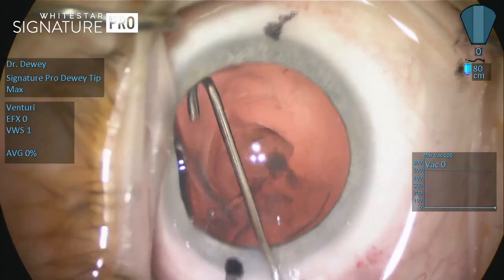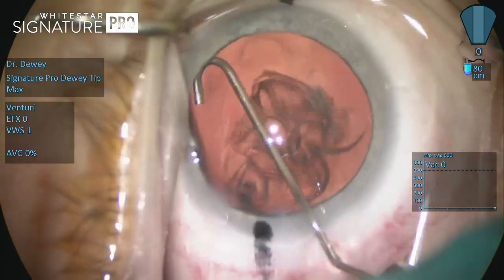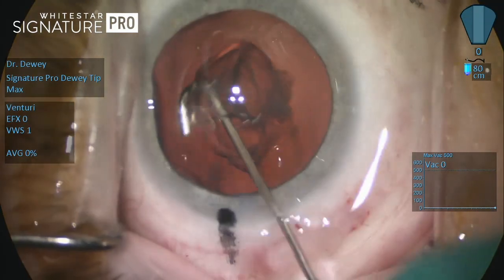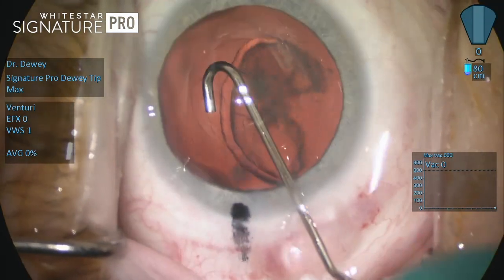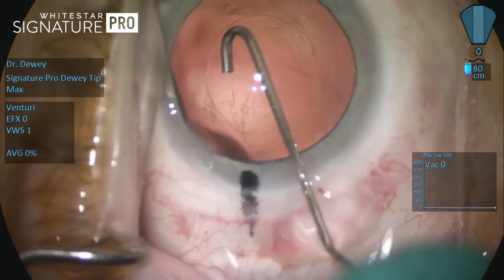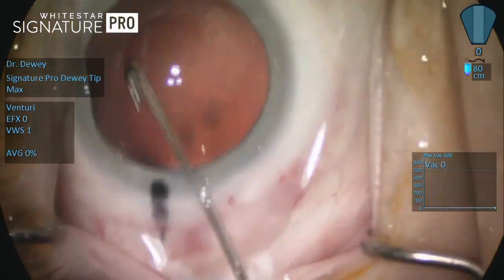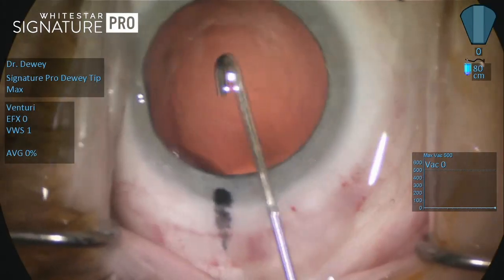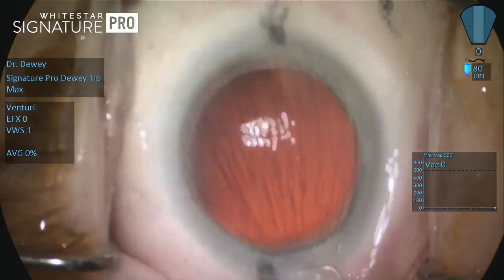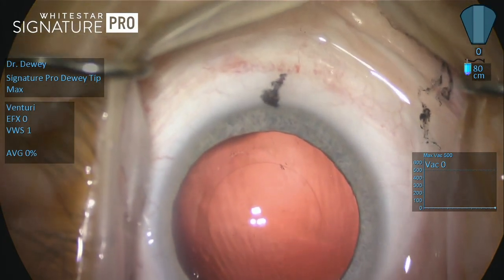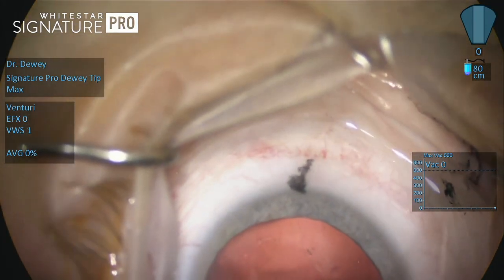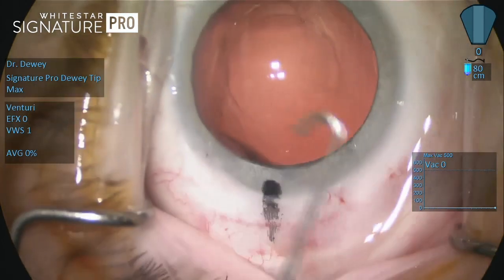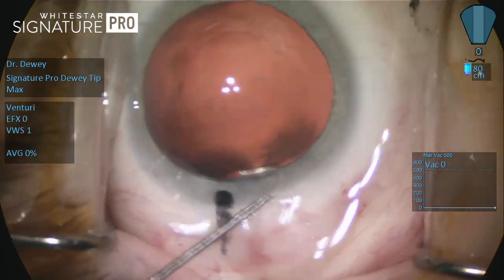One of the other features of the White Star Signature Pro system is a bit of a legacy. I am using the dual-linear foot pedal, which allows for a variable rise in vacuum magnitude simply by swinging my foot to the right. I found it a bit challenging at first, but by accident found that if the foot pedal is canted to the left, one has to learn to avoid the dual-linear control because your foot will naturally kick the pedal to the right.